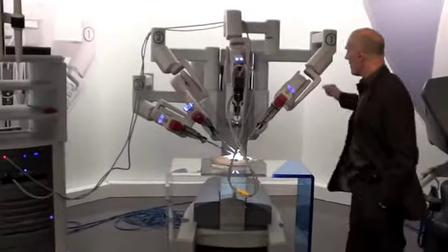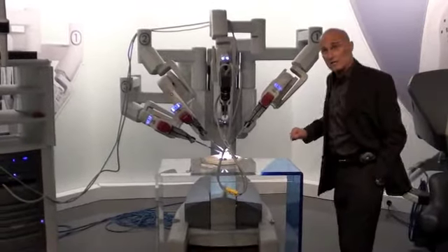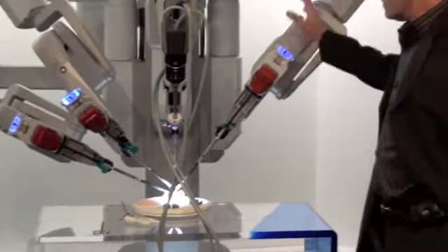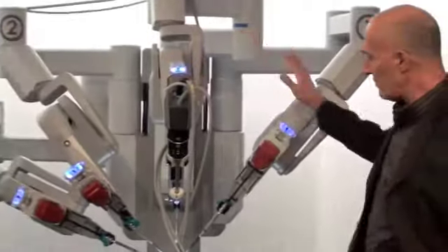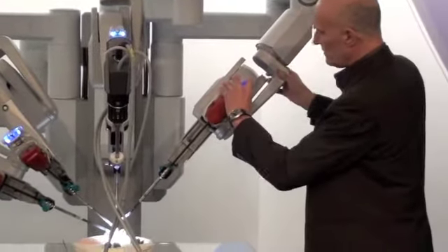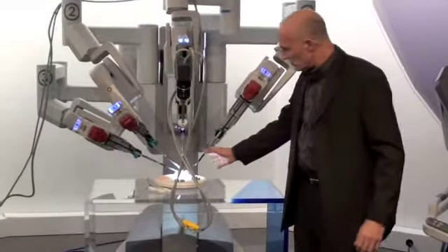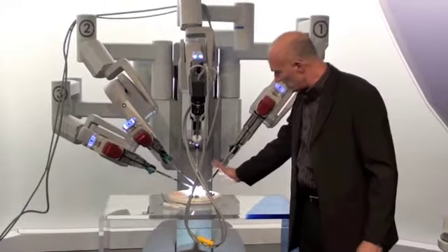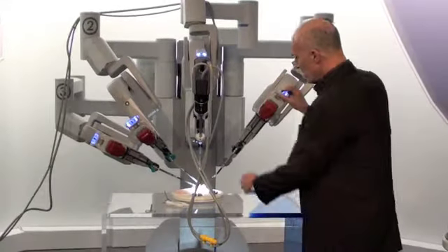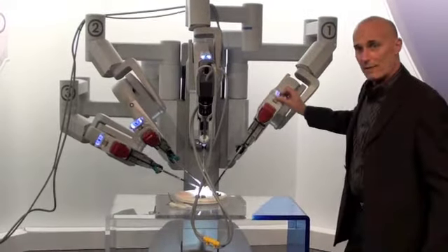This is the patient cart. This is what is attached to the patient. What a surgeon does is he'll put the ports into the patient, and there are one camera arm and three working arms. This is an example of how they move. The unique feature of this is once it's placed within the ports, there's a rotational fixed point so that any movement occurs around this fixed point, so there's no injury to the patient's abdomen.